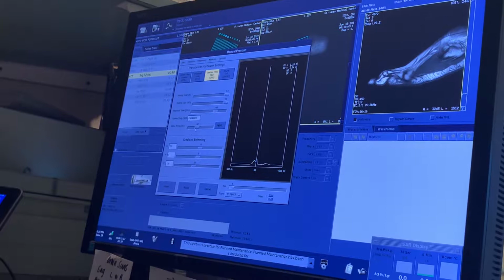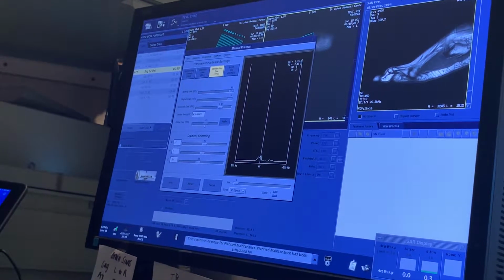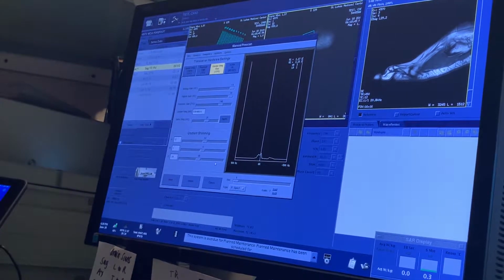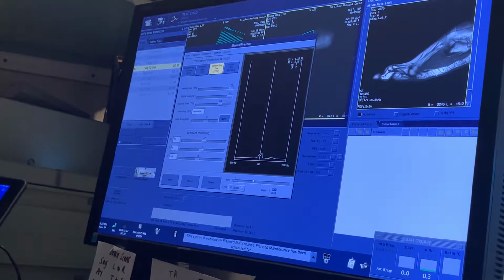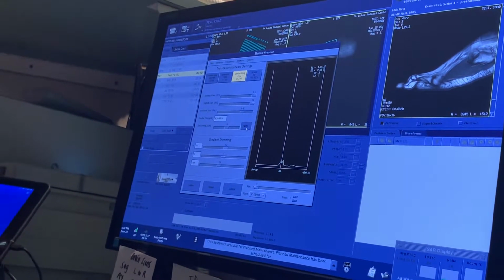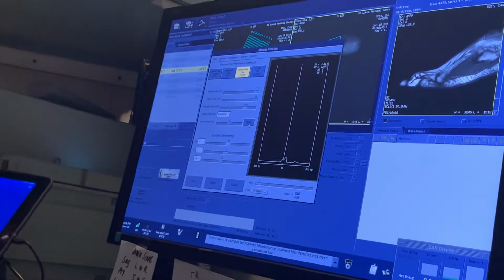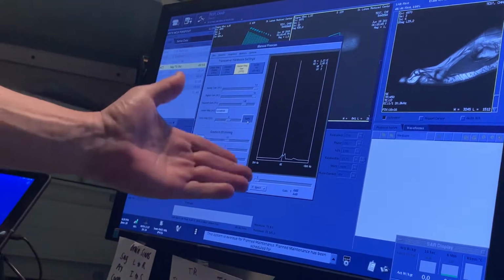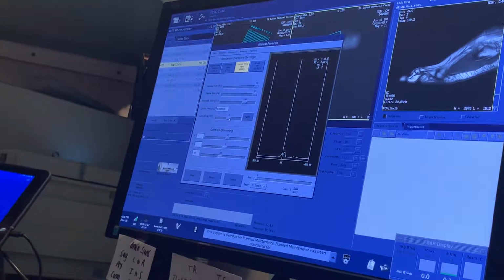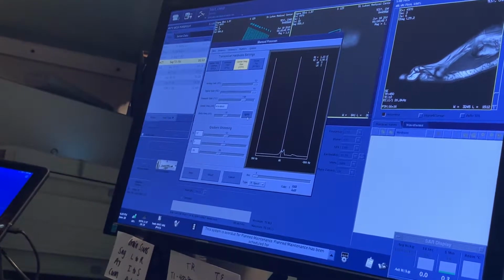Again, if I want to adjust it, let's say I want to put the line on this peak here, I'm just going to pick maybe about 30 and hit apply, and it's going to move it over. And I didn't go quite far enough, so I might add another 6 or so until I'm right on that peak, if I chose to do that. I don't know why. Normally it's 1 peak. I don't know why it's 2. So let's just go back to negative 36 or so to get it back to the other peak.